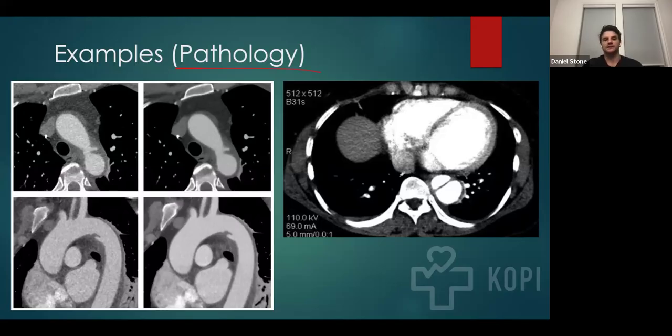The last thing here is basically the angiography studies timed for arterial sequences. So you can see here an example of a subtle aortic dissection. Right here is the dissection flap. This is basically not good. This patient's probably hypertensive. They're probably in a lot of pain. They probably have chest pain. 80% of people with dissection present with chest pain.